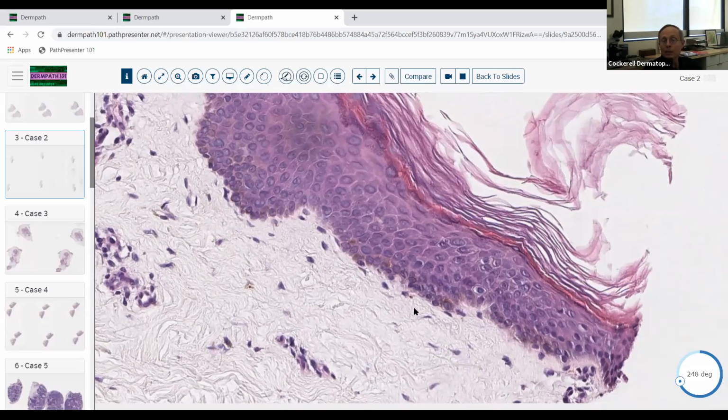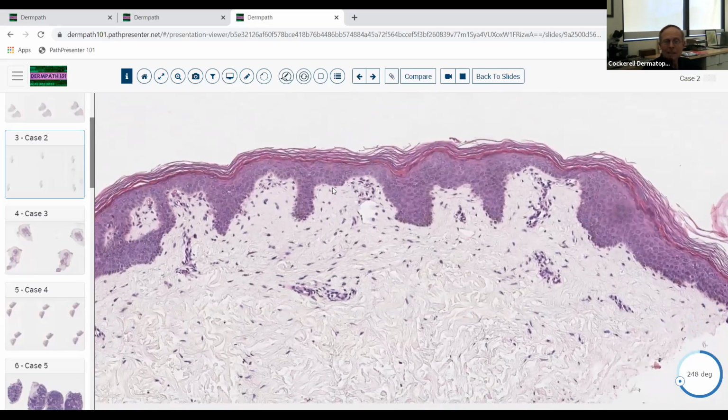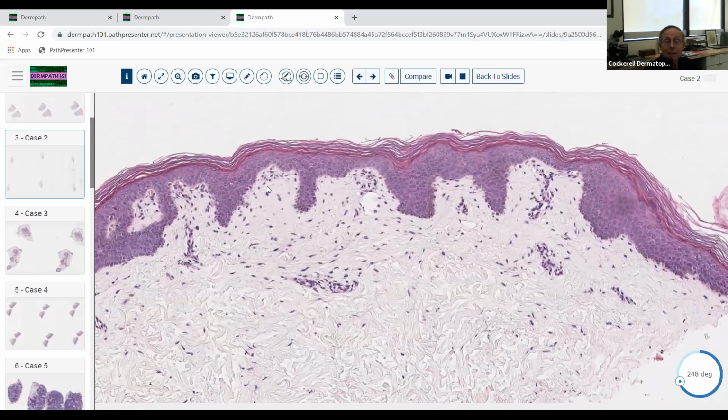Now, what else could give you this pattern? Well, if you had a subtle manifestation of, say, atopic dermatitis, that could look like this. A drug eruption, drugs can do anything, so that could possibly look like this. It'd be a sparse drug reaction, maybe a viral exanthem. But because those all look pretty similar, they're not going to put something like that on an examination and expect you to sort them from one another. If you had a pattern like this that had a lot of eosinophils in it, or maybe if they had a PAS stain and it showed some spaghetti and meatballs in the cornified layer, well, that might obviously be tinea versicolor.